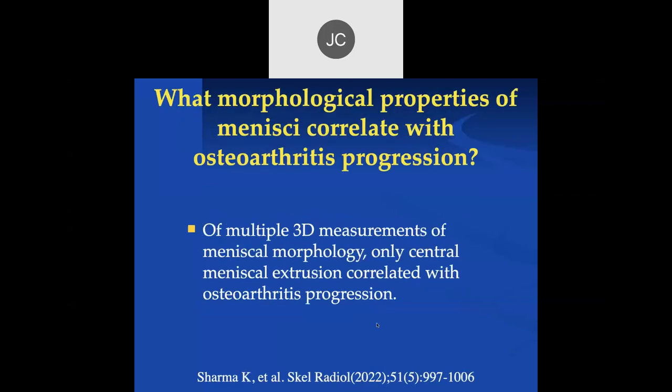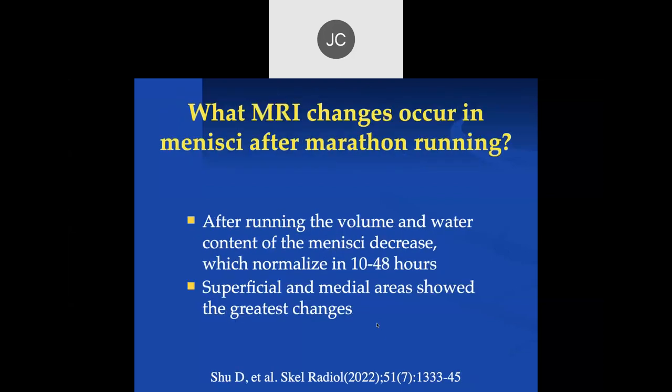And we'll talk more about, well, we've already talked some about the central extrusion that's typically associated with root tears, or also with large degenerative tears of the meniscus.